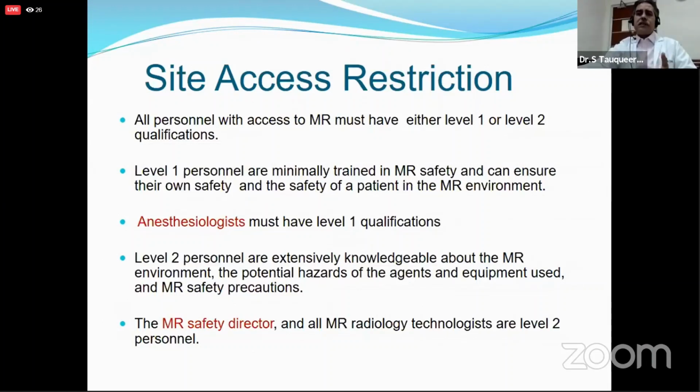So say anesthesiologists who come to the MRI room for anesthesia purposes should also have level 1 qualification. They should know certain things about the MRI magnet, what things should be taken inside and what should not be taken inside.